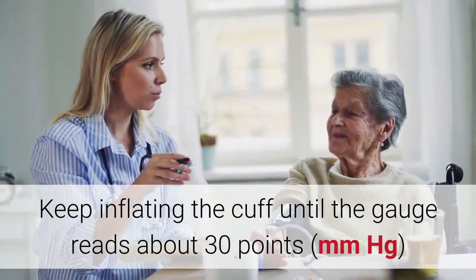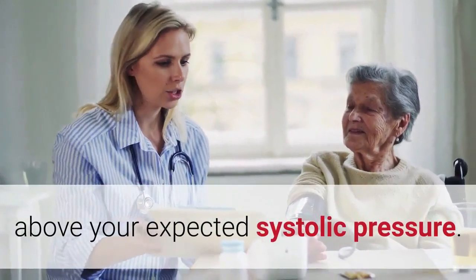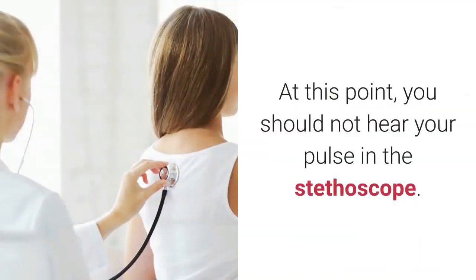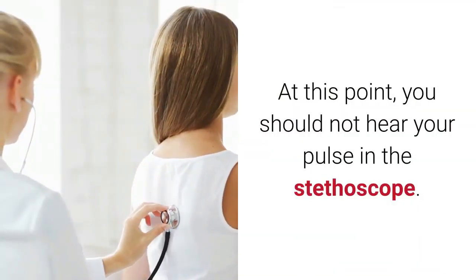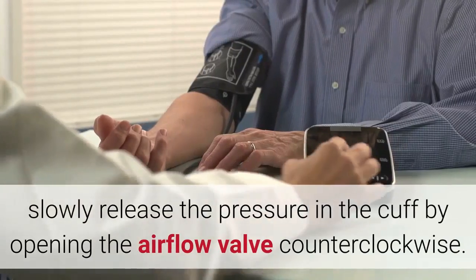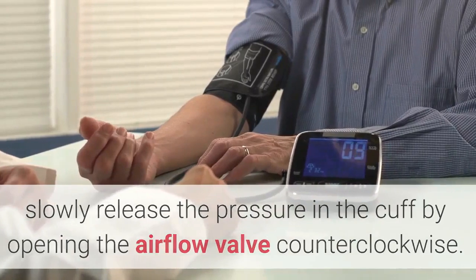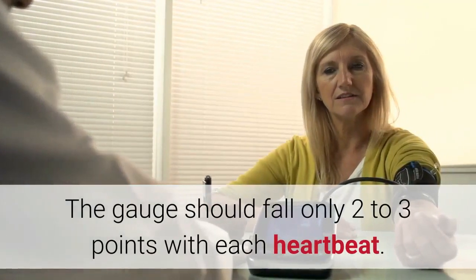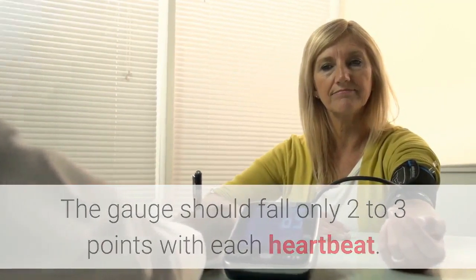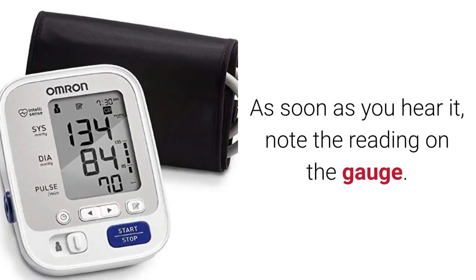Keep inflating the cuff until the gauge reads about 30 points mmHg above your expected systolic pressure. At this point you should not hear your pulse in the stethoscope. Keeping your eyes on the gauge, slowly release the pressure in the cuff by opening the airflow valve counterclockwise. The gauge should fall only two to three points with each heartbeat. You may need to practice turning the valve slowly.